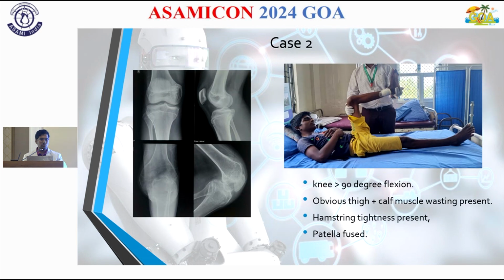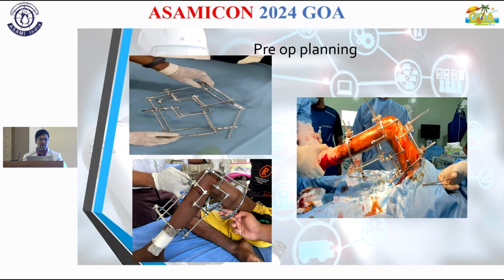So this case too was done by my colleague, Dr. Lakshmi Narayanan. Similar to that, this is a FFD knee, where this is mainly to show you a pre-operative planning and assembly should be applied over the knees.